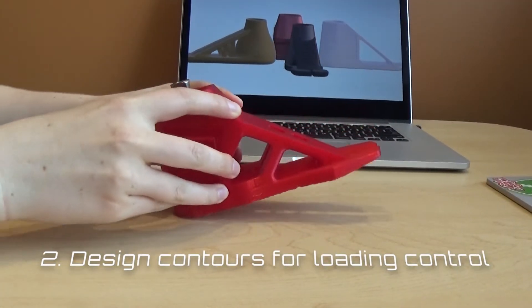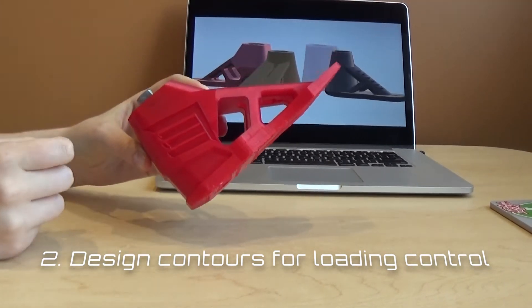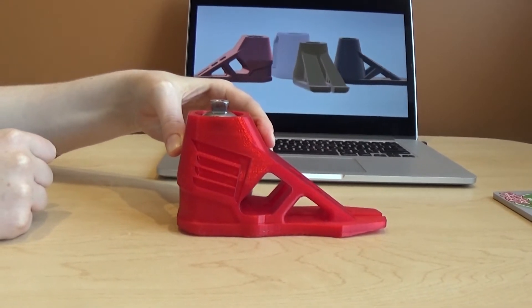Second, a rounded heel assists in keeping momentum moving forward during the heel rocker of loading response, allowing the child to have some added control over the speed at which his foot flattens onto the ground.